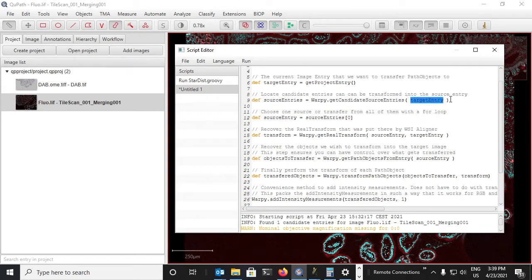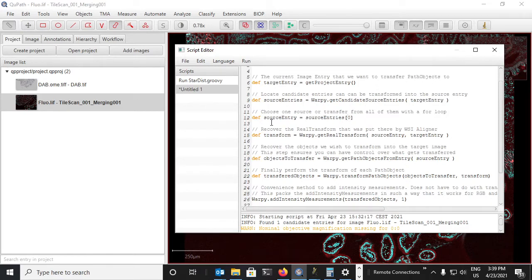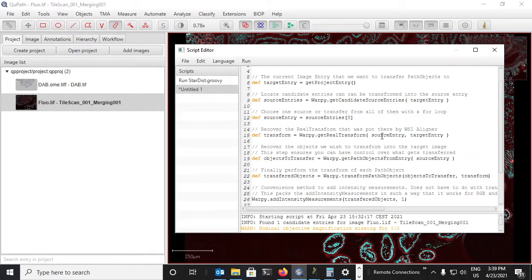That can be transformed into this target. In the case that there are many, we have to select one. So here I select the first one. In our case it doesn't change much, there is only one other image. From there we can request the actual transformation that allows us to go from the source, so the image we're interested in, to the target, which is the image we are opening now.